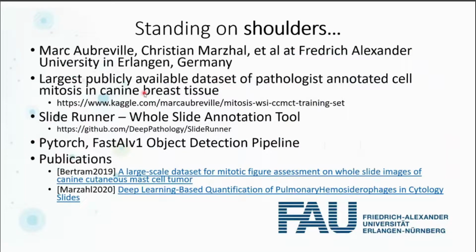Before I jump into the code, I just want to give acknowledgement to a group of folks that I've been borrowing from and who have done a ton of work in this space. The folks at Friedrich Alexander University in Erlangen, Germany, have done a ton of research and provided some excellent datasets.